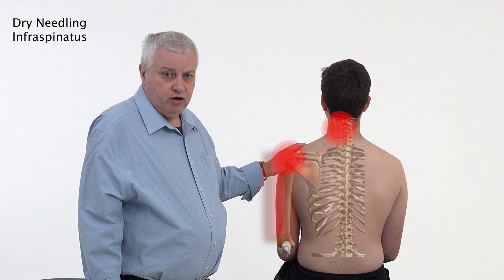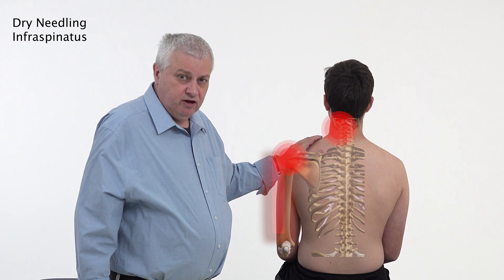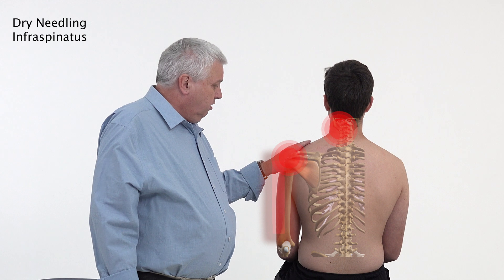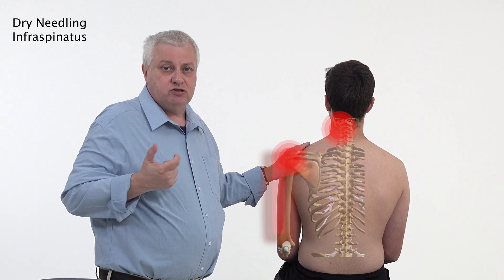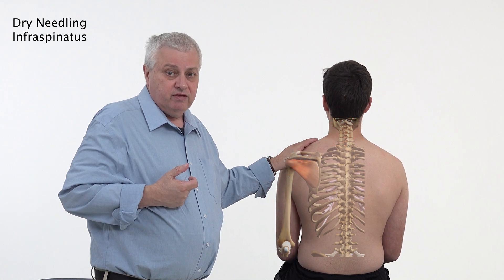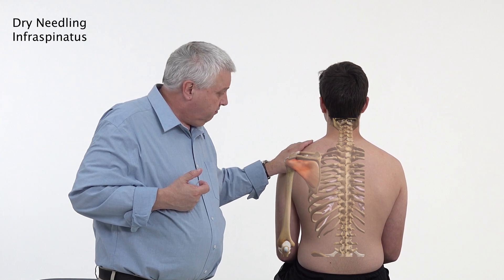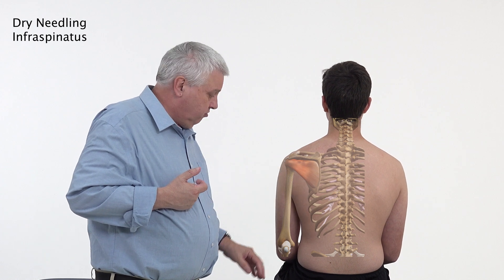These myofascial trigger points can cause symptoms that are often mistaken for adhesive capsulitis or frozen shoulder. It's quite an important muscle - somebody may be coming in with a frozen shoulder or adhesive capsulitis, and by needling this area along with the teres minor muscle, you can have quite an effect on the frozen shoulder.